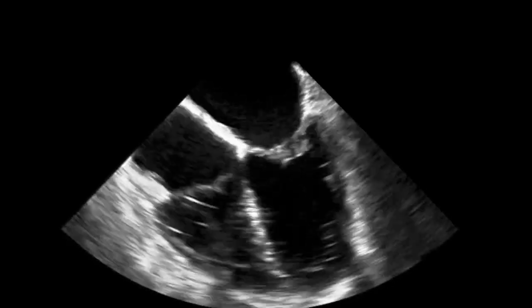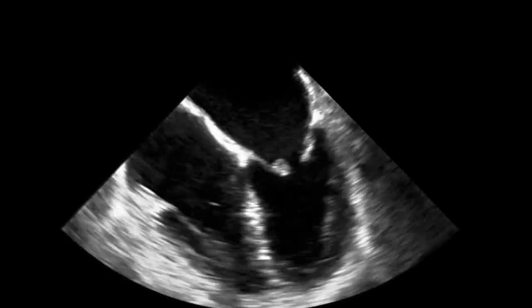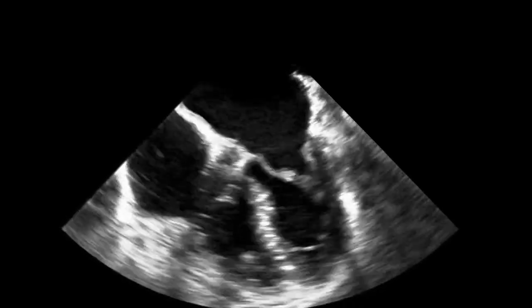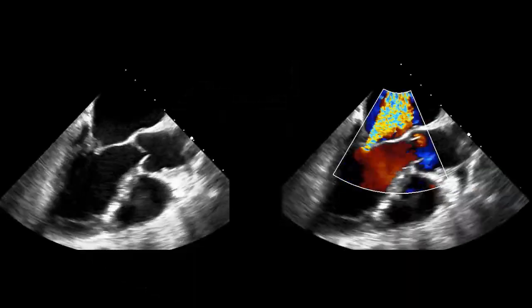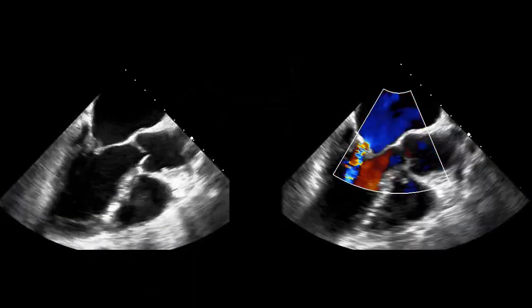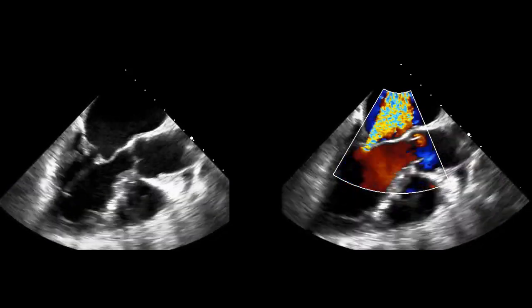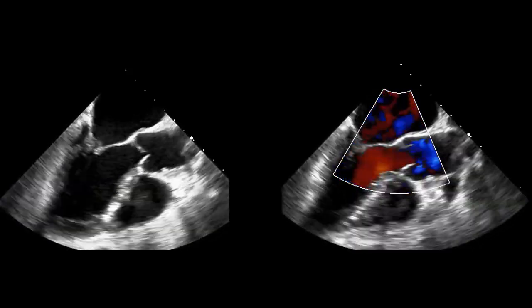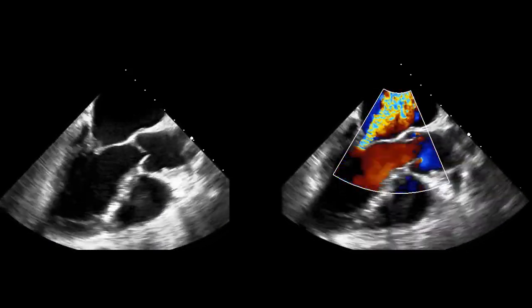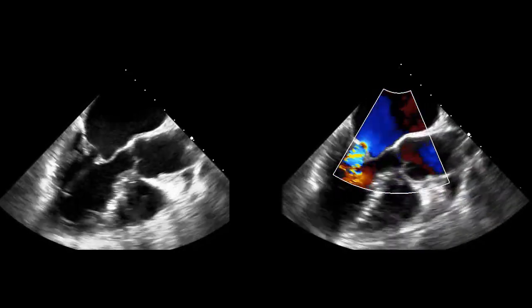Transesophageal echocardiography is very useful to evaluate mitral stenosis. Indeed, this is indicated in situations where transthoracic images are difficult to obtain and under intraoperative monitoring.